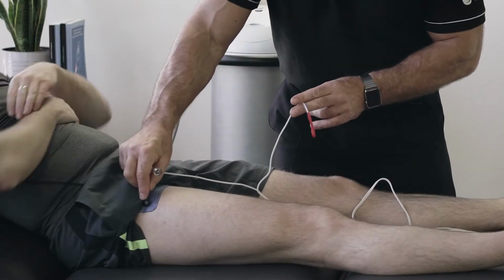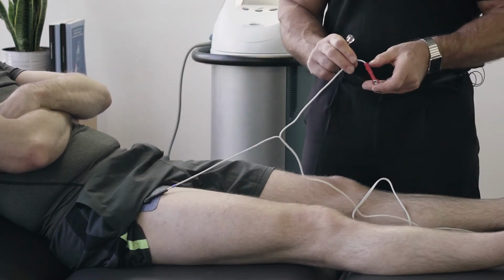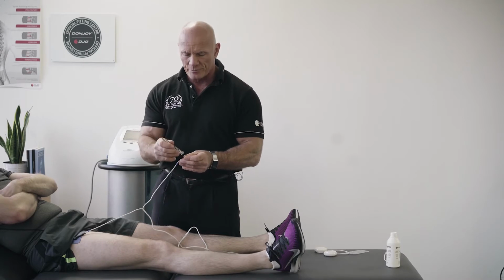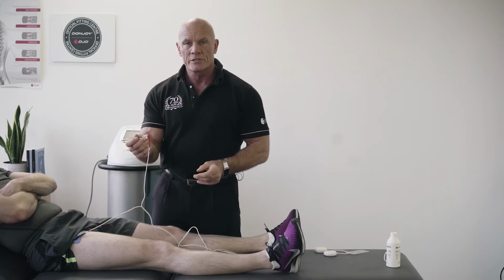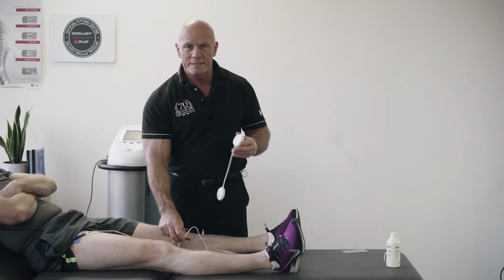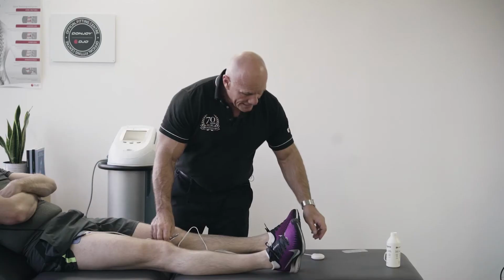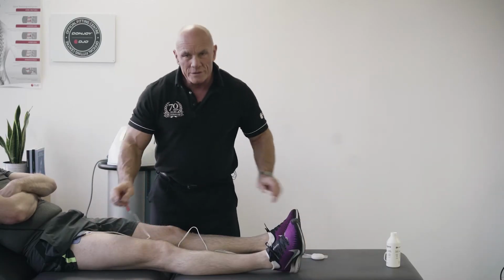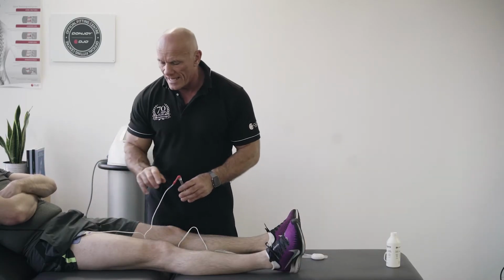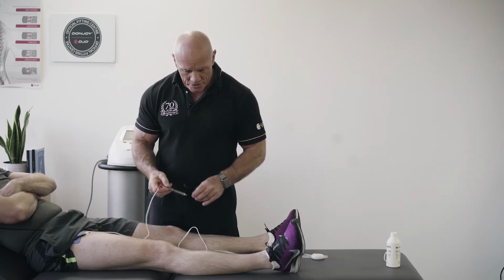We put a reference electrode at the top of the muscle group that we're looking to work, and then we attach our motor point pen to the other end of the electrode. For those of you who are using wireless technology, you can also still use your motor point pen by clipping it into the wireless pod. The electrodes we use have a water-based gel in order to allow the impulse to travel through this very resistant material called skin.